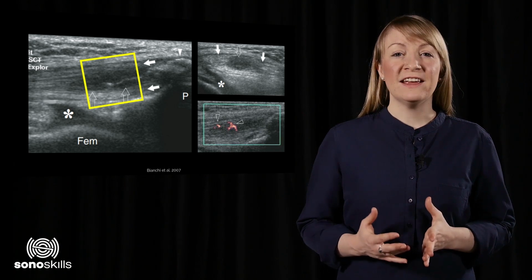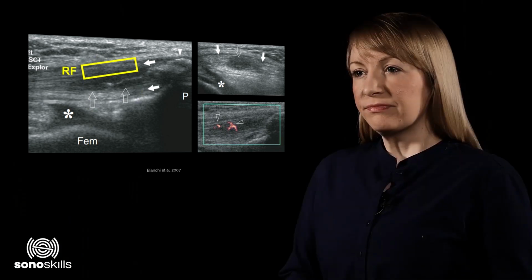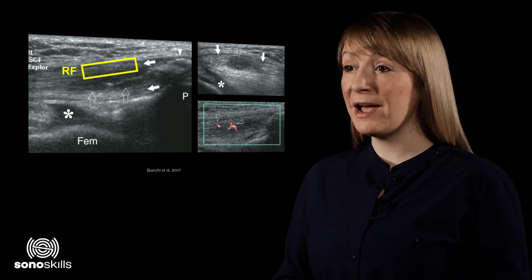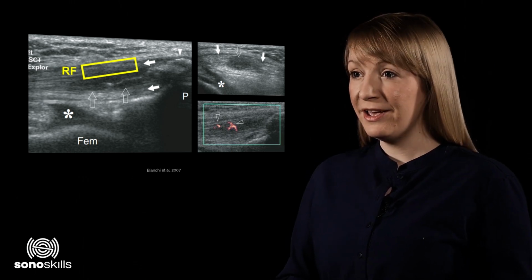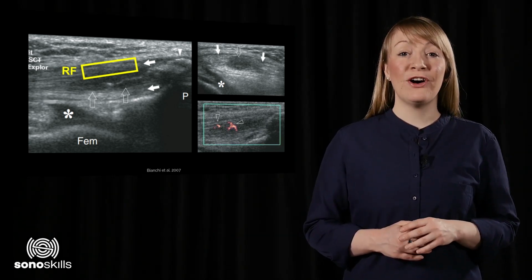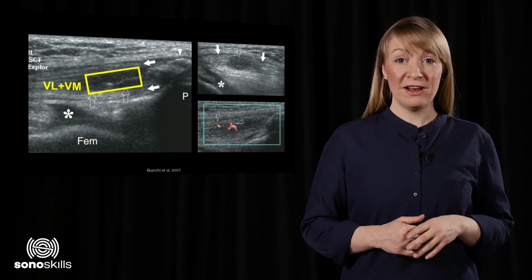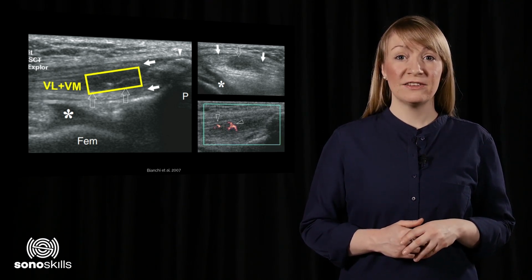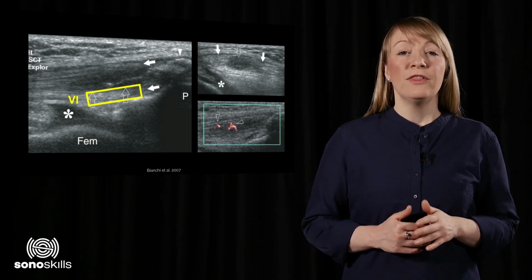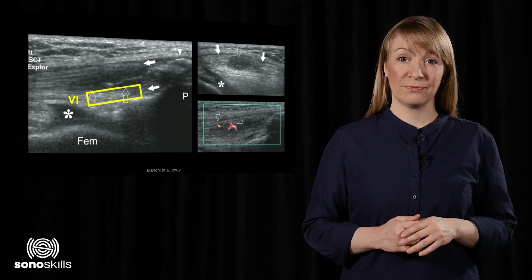The echogenicity of the quadriceps tendon has changed in various ways. The upper layer of the tendon, containing the rectus femoris fibres, are hypoechoic because of a moderate tendinopathy. These tendon fibres are in disrepair. The fibres of the vastus lateralis and vastus medialis show for the biggest part anechoic. The fibres of the vastus intermedius show the normal echogenicity.